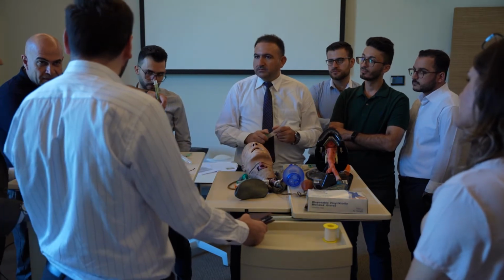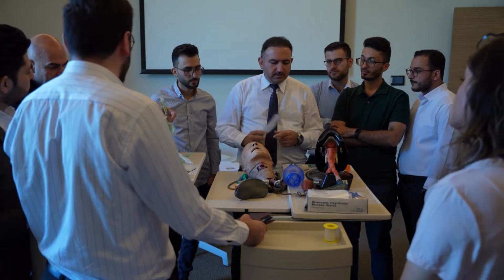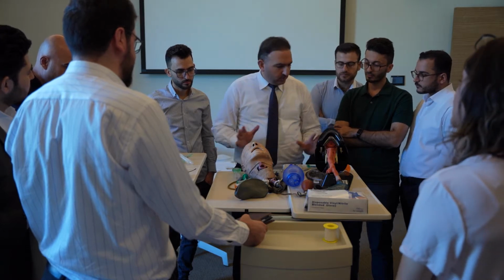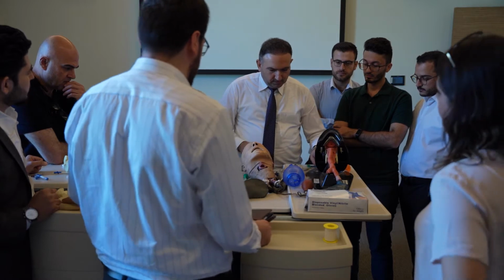But it's much easier. It's a blind technique, easier for ventilation, and better than the oropharyngeal airway. So simply, these are what you need: nasal airway, oral airway, nasopharyngeal airway, tube.